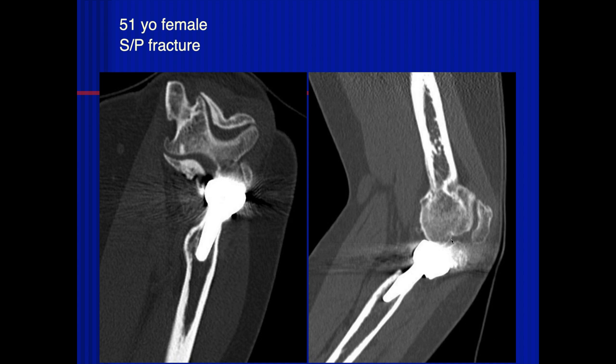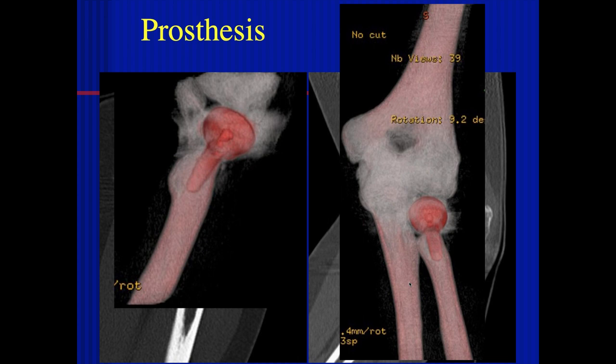I'm trying to figure out if it's just angulation or if there seems to be quite a bit of surrounding heterotopic bone, or is that just the cuts? Yeah, I think it's kind of the cuts. But there probably is a little bit of heterotopic bone here and maybe some here. Okay. I'm kind of worried that on that second image the radial head arthroplasty looks a little bit angulated. I'm not sure if that was purposeful. Yeah. They really didn't do anything about this, but the patient did have pain.